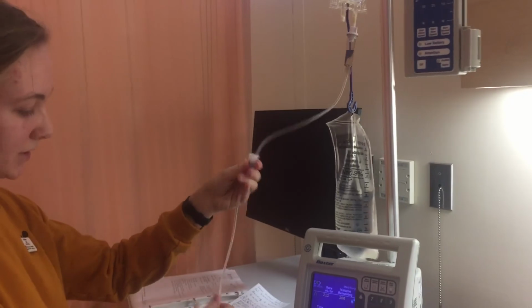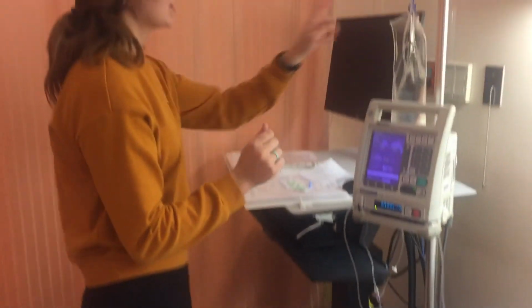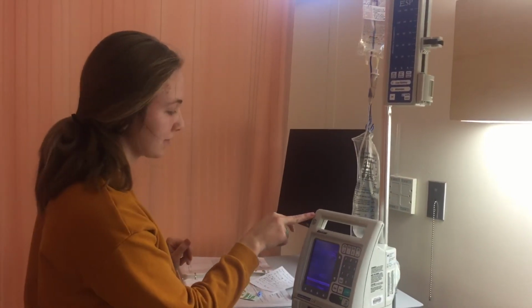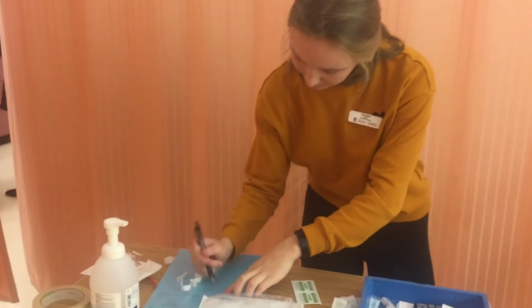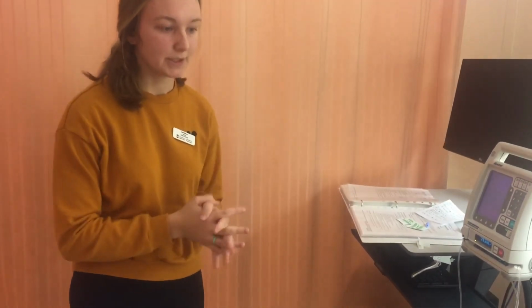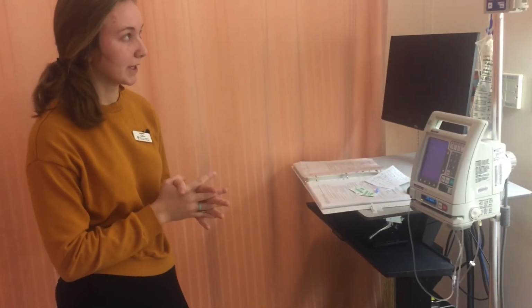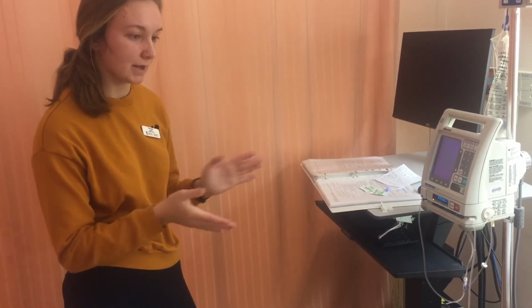I'm going to make sure all of the clamps are undone. So make sure this clamp is undone, make sure all these clamps are undone, and they look good. I'm going to watch to make sure that there's 3 drops going, and I see 3 drops. And now I'm going to sign my MAR. So I'm going to sign date and time that I gave the medication, and now I'm going to tell the patient, okay, so I'm going to come back to check on you in about 30 minutes. That's when your medication will be done infusing, and we just want to make sure that you're doing okay.